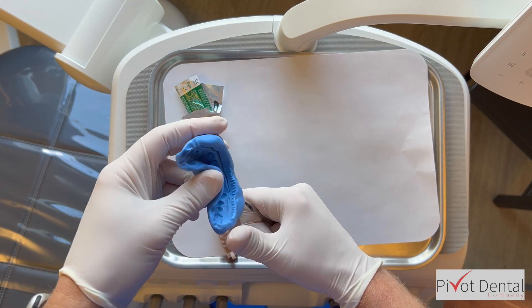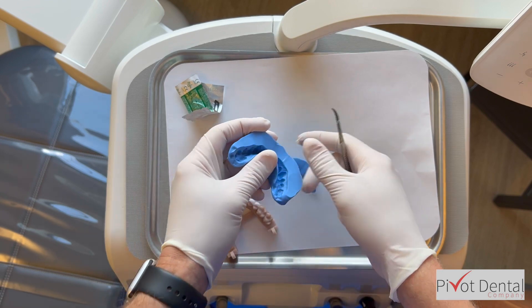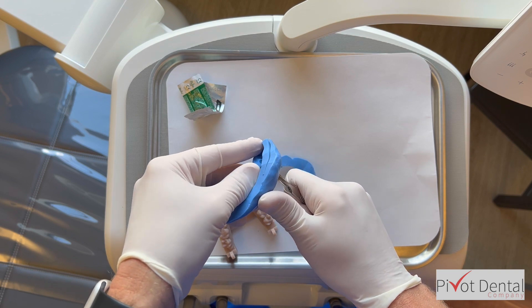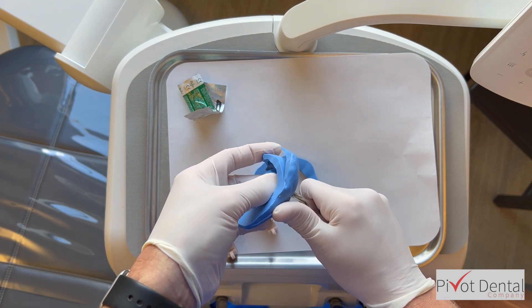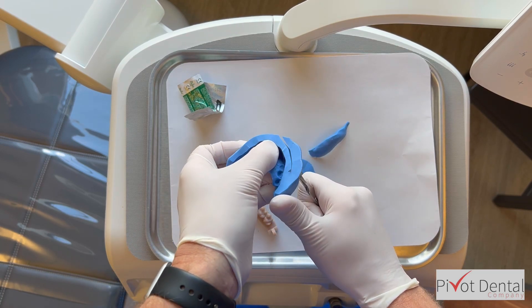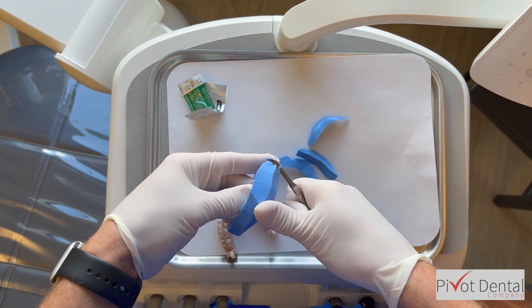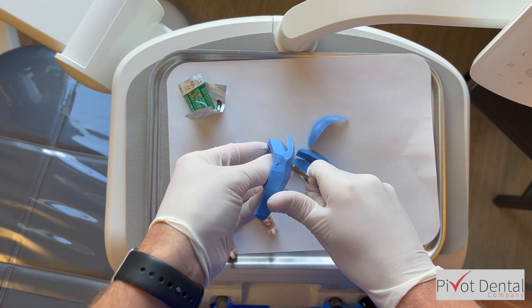That processed part of the model doesn't match the patient's true anatomy, so I'm trimming it away — reducing it vertically but staying away from the gum line, which I want to preserve. Now I'm taking the excess thickness on the lingual side and trimming that back. This is a scalpel blade so it's very sharp — be careful so it doesn't slip and cut your finger, hence the gloves for the extra added layer of safety.